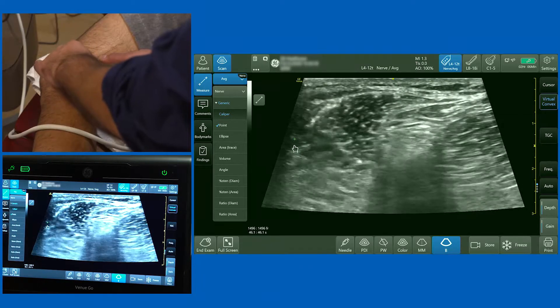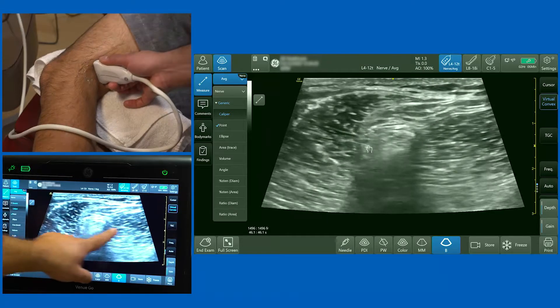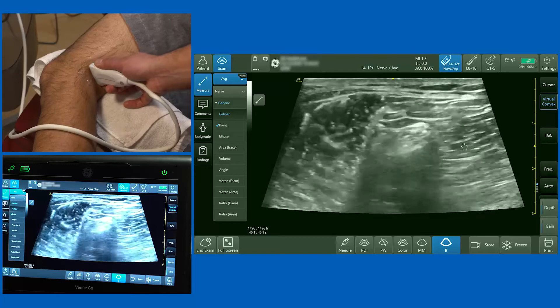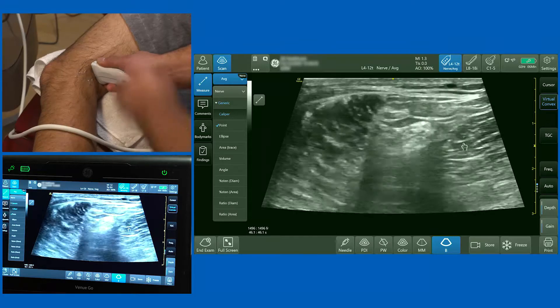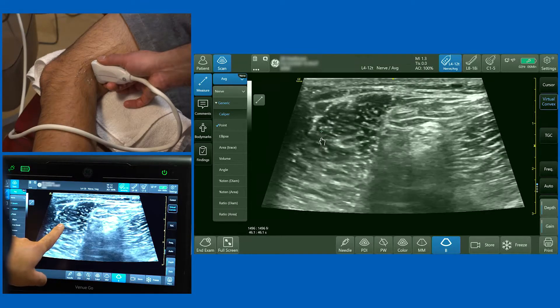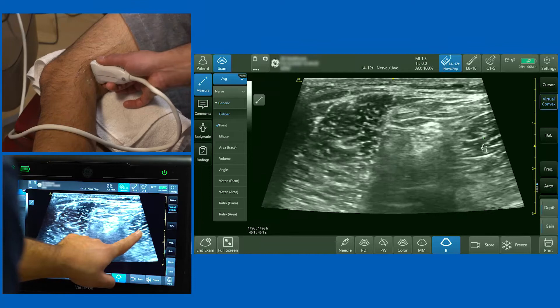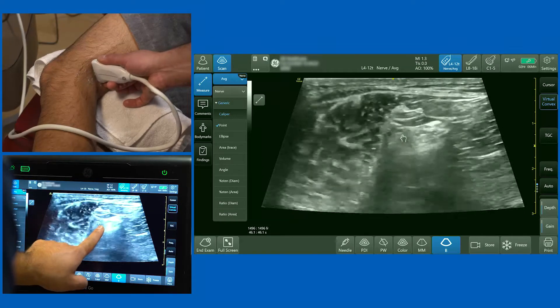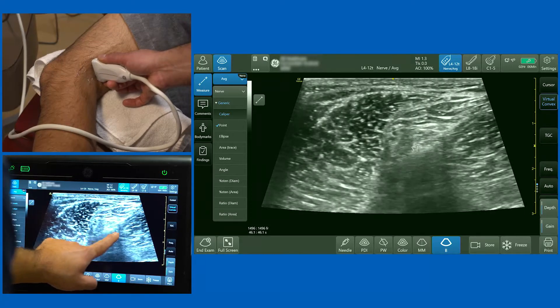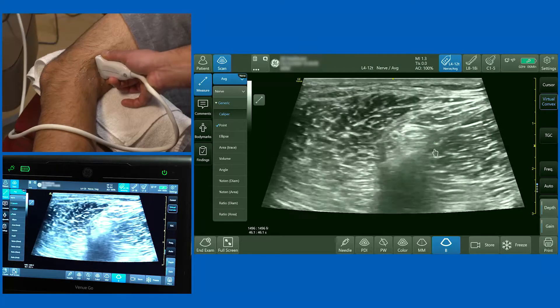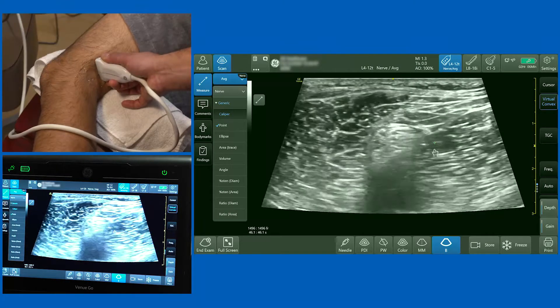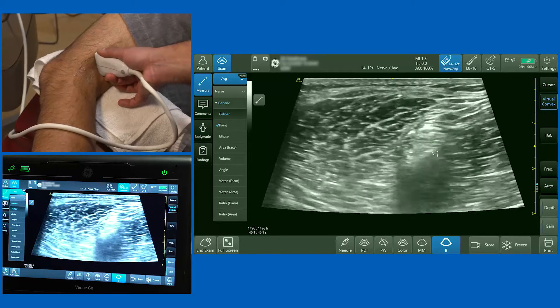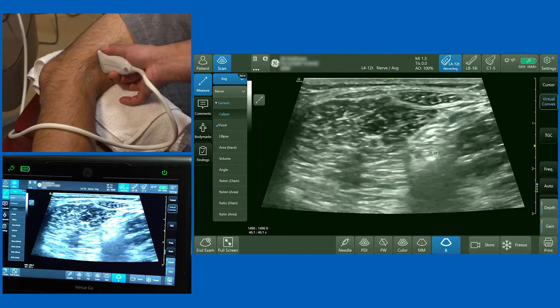Looking at the lateral aspect, this is the biceps femoris muscle, and medial to it are the muscles of semitendinosus and semimembranosus. So laterally biceps femoris, medially semitendinosus and semimembranosus, with the common fibular/peroneal nerve and tibial nerve between them. As I scan up the leg you'll see the two nerves have joined at this point to form one structure.